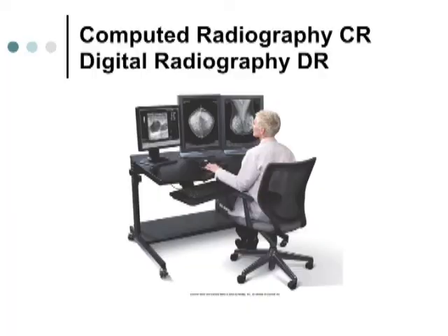Okay, so what about computed radiography? Well, this is the new craze. This is what everybody's going to, and it's here to stay. With computed radiography, CR, I'm not talking about DR, which is digital radiography. Computed radiography also has a cassette with it. Okay, it has a holder for it. But instead of film inside of the cassette, we have a phosphor plate. The phosphor plate is made out of polyester. It has the phosphor painted on the top of it.